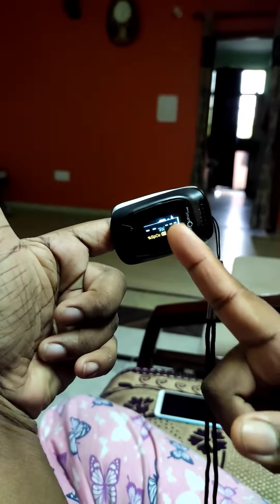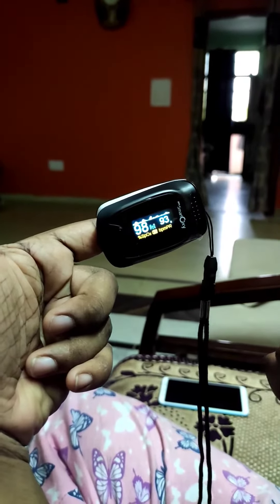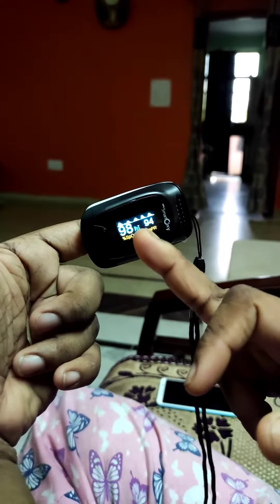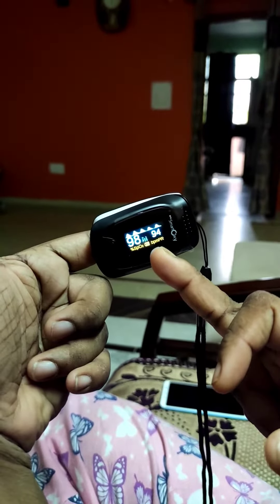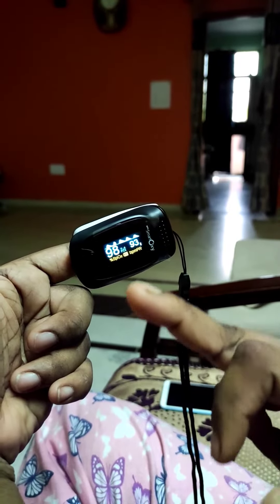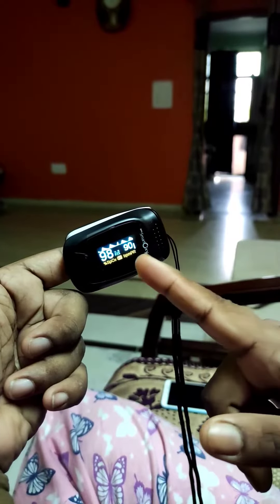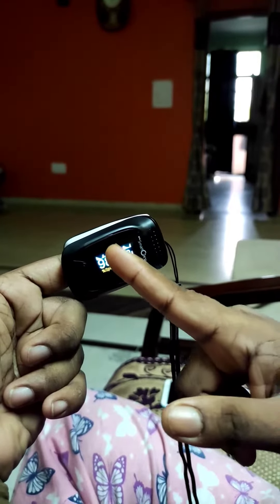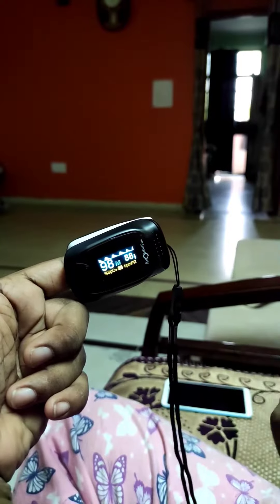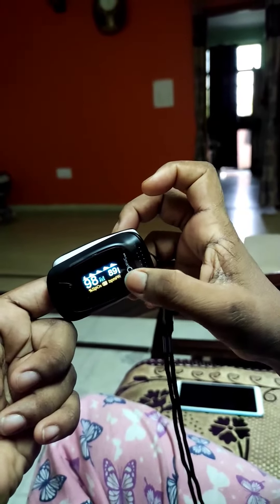Now on the machine you can see a graph-like display. It is monitoring your oxygen level. Here it is written percentage SpO2 and BPMPR. The percentage SpO2 will tell you your oxygen level, and BPMPR is the pulse rate — beats per minute.